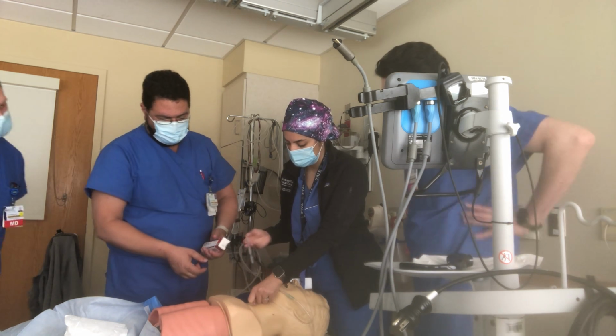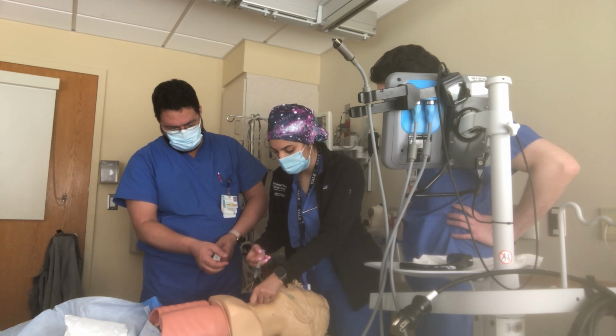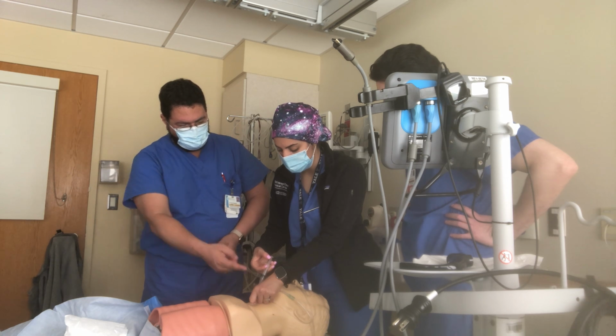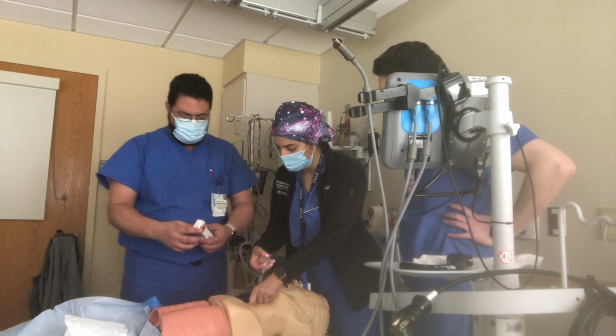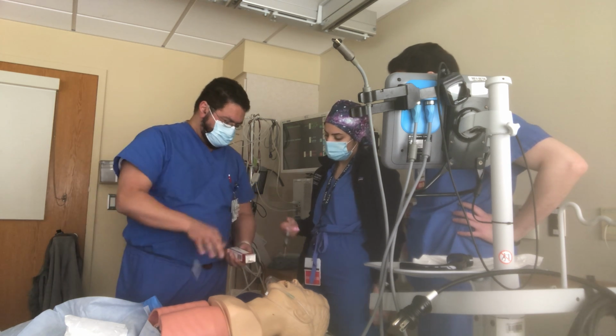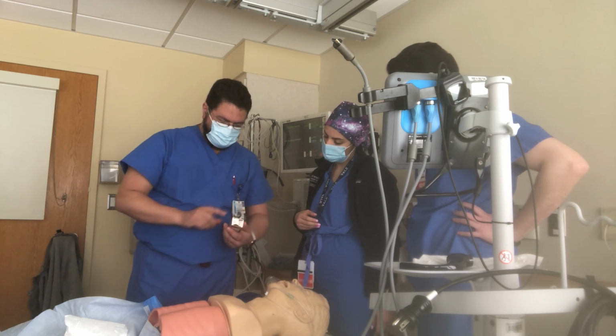This is the needle cric, right? Yeah. Perfect. Yeah, just like that. And as you go in, you go in slowly. Once you see bubbles in here, that means you're in. So let's puncture this and assume that this is the patient. So we puncture this here, right? We know that we're in, right? What's next?